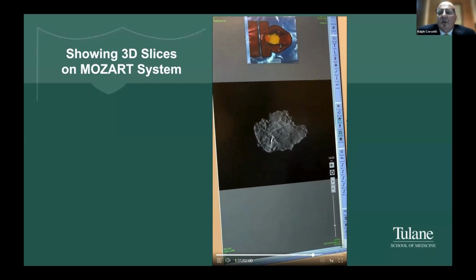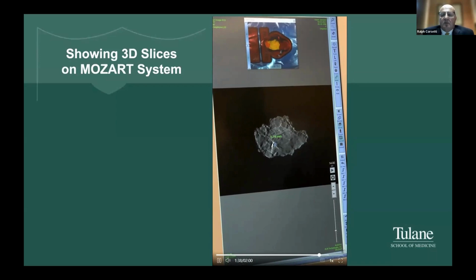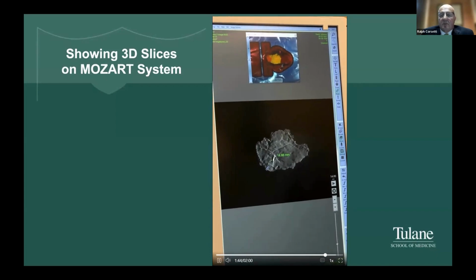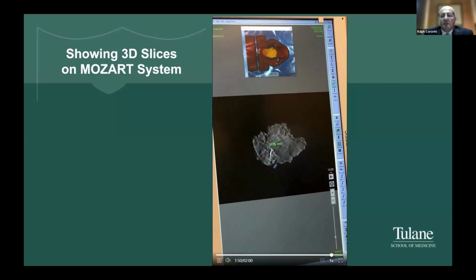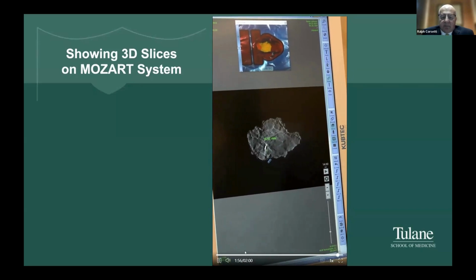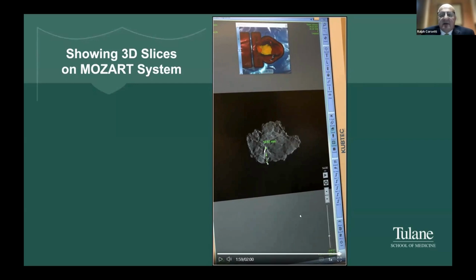And then we can also measure our peripheral margins with a ruler. So we can say here's the biopsy site. And a distance of 1.5 centimeters to the periphery here. And so we can see there, using the ruler and the caliper, I try to achieve a gross centimeter margin, excellent margin there. I didn't re-excise. So I'll probably re-excise in my patients, probably 20% of the time.